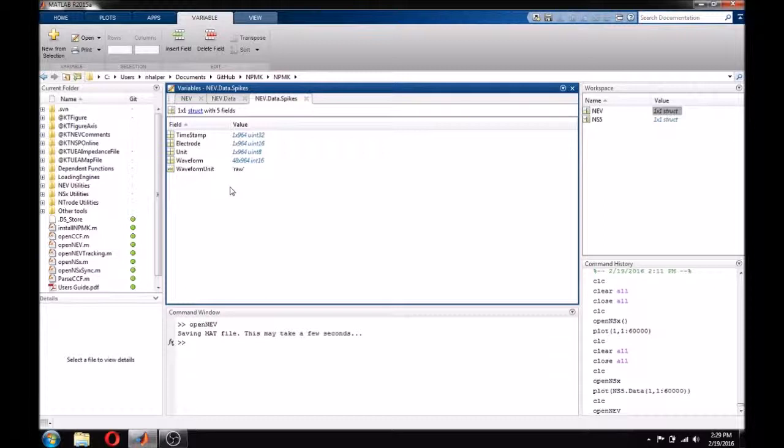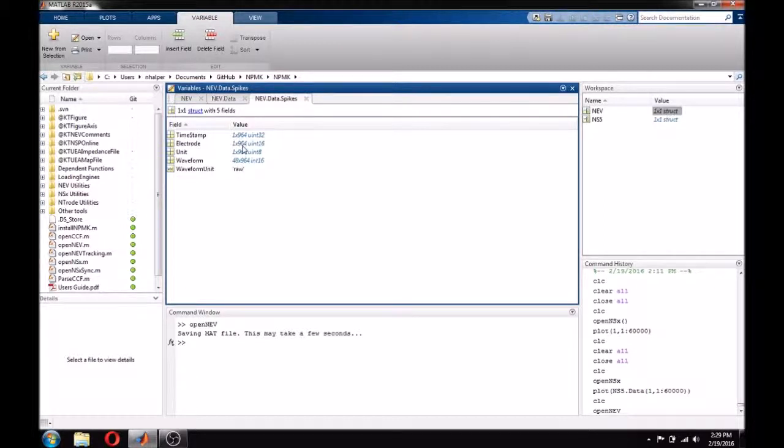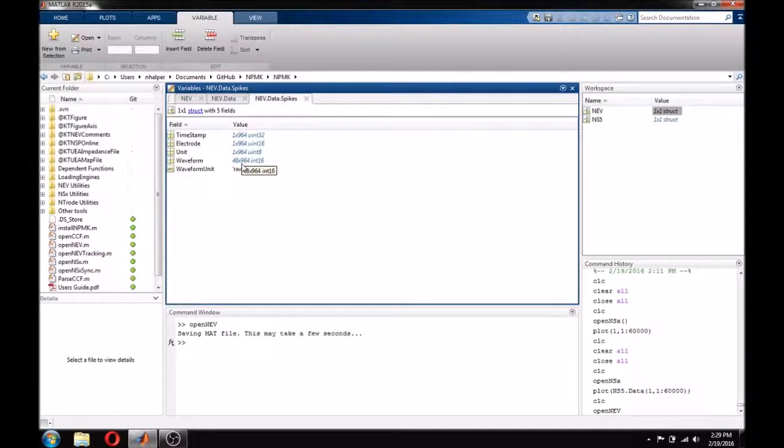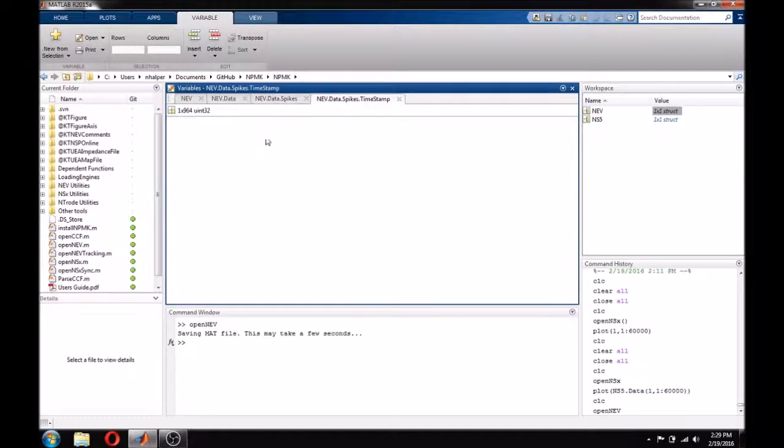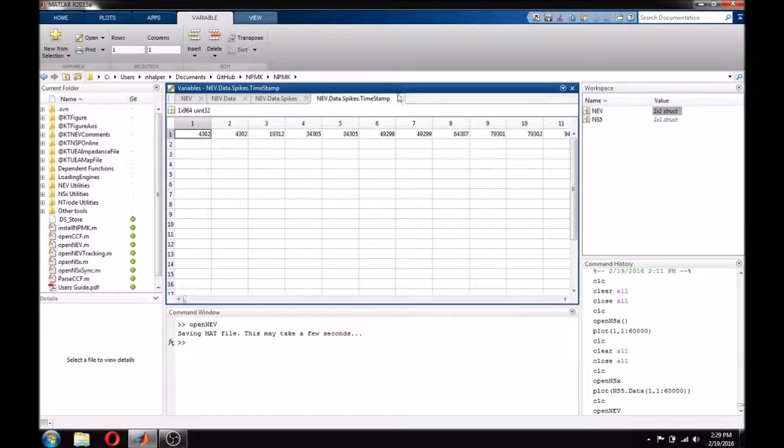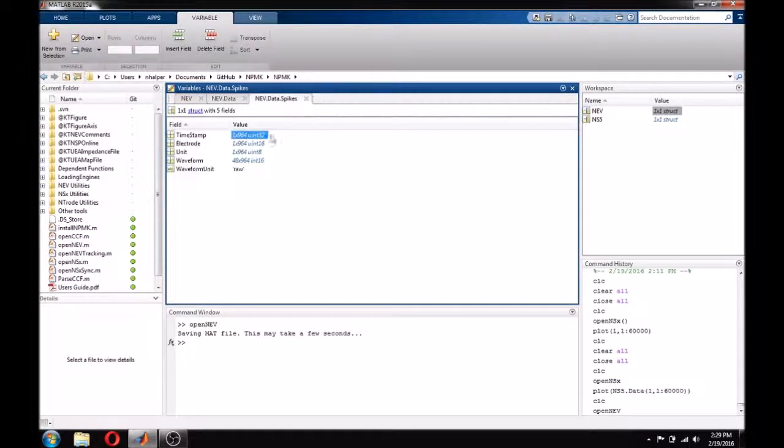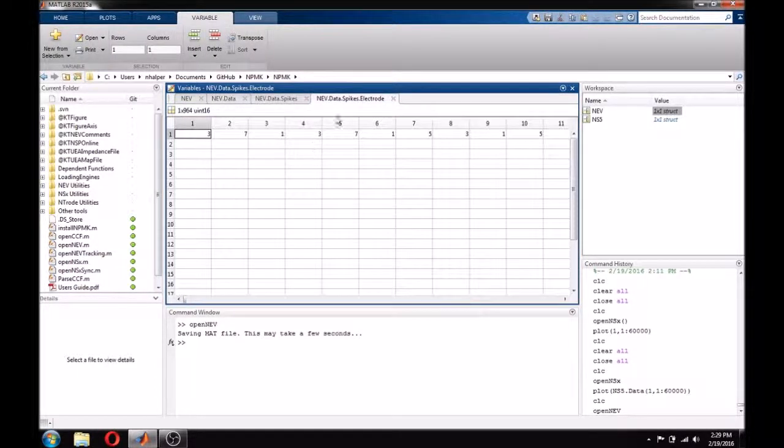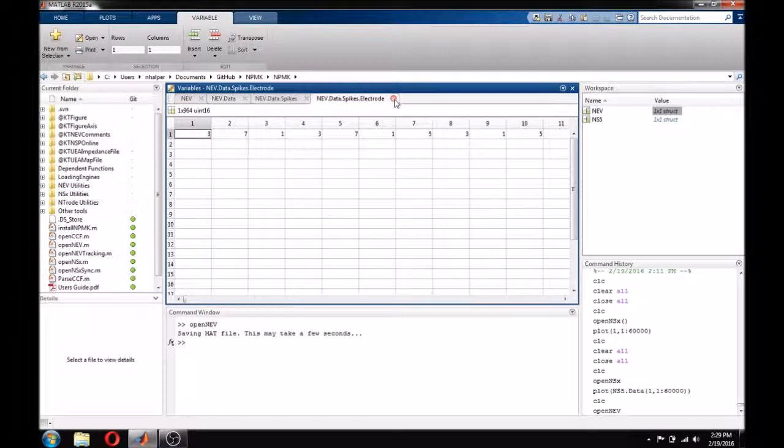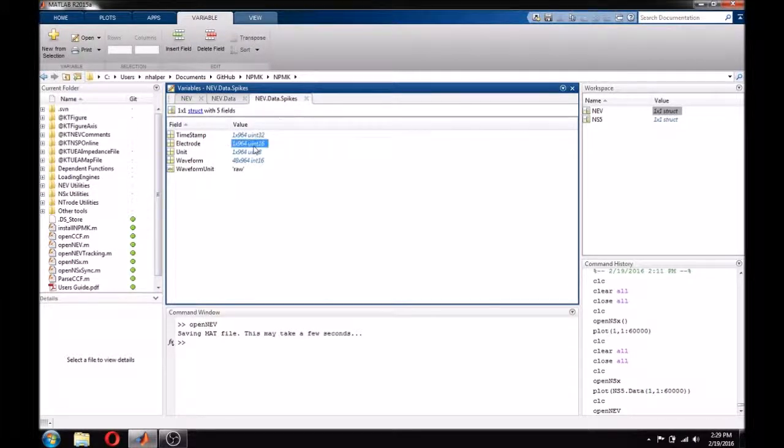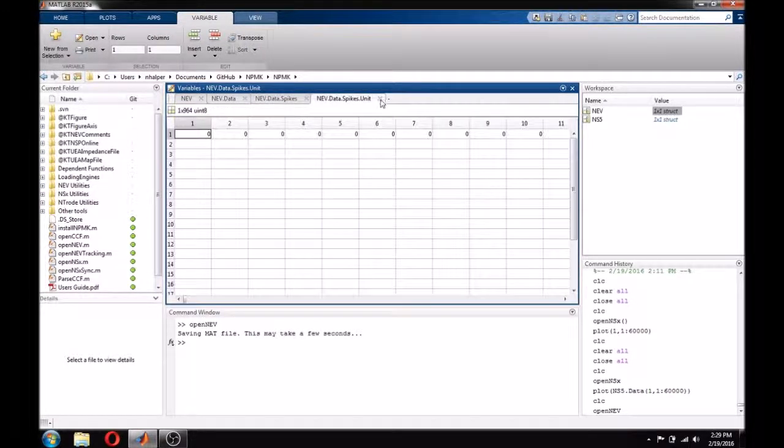Thus, the first entry in the timestamp field is associated with the first entry in the electrode field, unit field, and the first column of the waveform field. For example, I can see that our first spike happened at timestamp 4302 on our 30k sample clock, it happened on electrode 3, and I can see the waveform values by looking here.